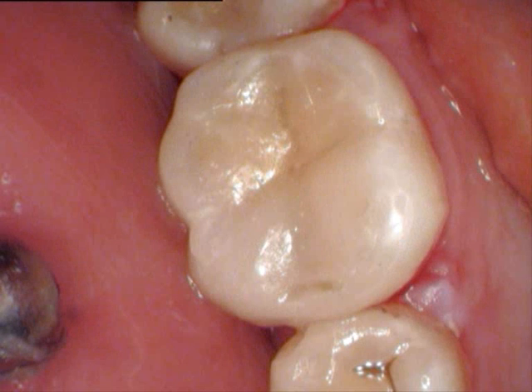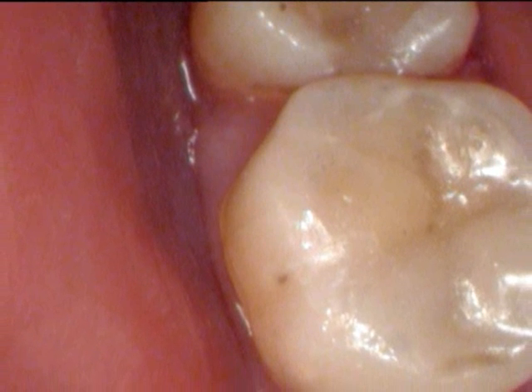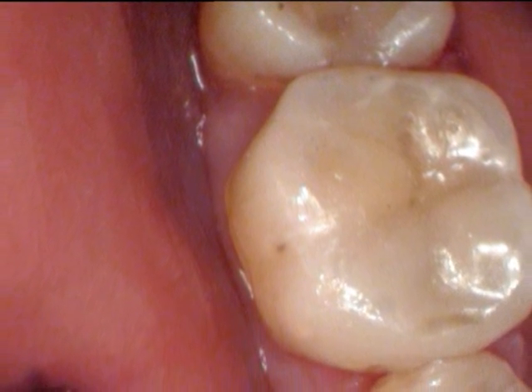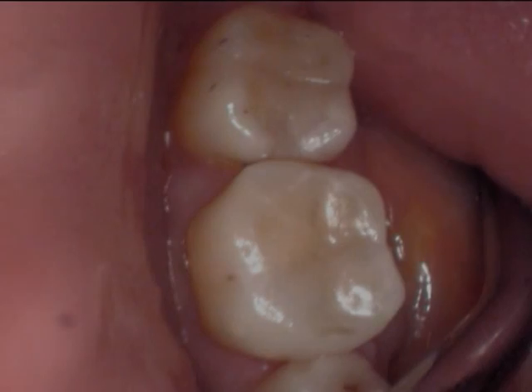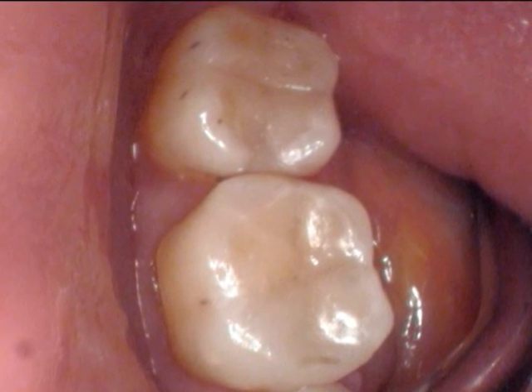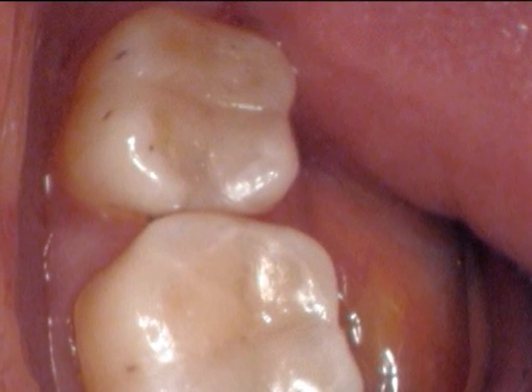We've bonded the tooth and built it up in incremental layers, aiming to shape the tooth to look more anatomical and as natural as possible. This takes a bit of time, and you can see the final result here with the fillings completed, in place, and polished. The bite has been adjusted and the shaping finalized to make it smooth for the patient.